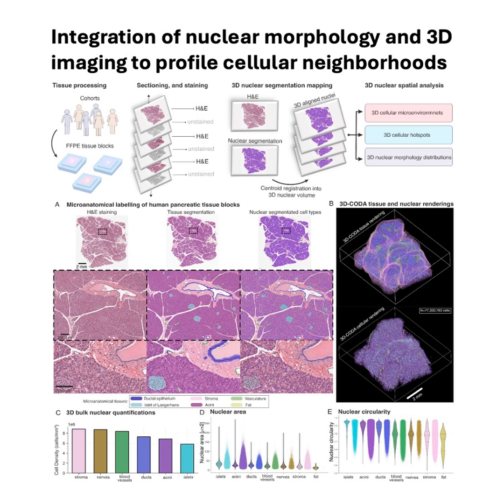And where were these true 3D hotspots located? They identified leukocyte hotspots, primarily near stromal regions, blood vessels, and epithelial structures like the ducts. Conversely, cold spots, areas with very few immune cells, were mainly seen in the islets and nerves. Okay, that makes sense. But was there anything really unexpected? Yes. This was a critical discovery. When they did the quantitative analysis comparing immune cell density around different structures, they found a significantly higher density of leukocytes around larger pancreatic ducts compared to smaller ducts. Larger ducts attracted more immune cells.